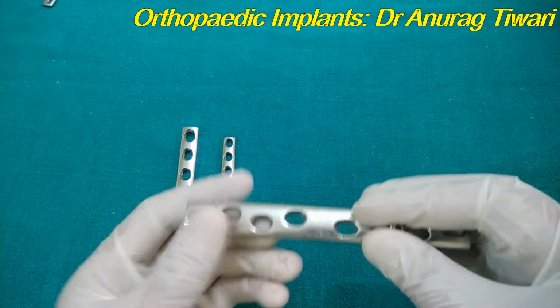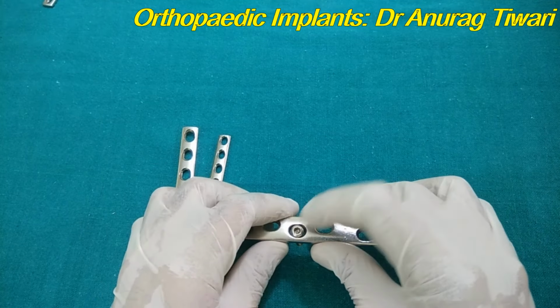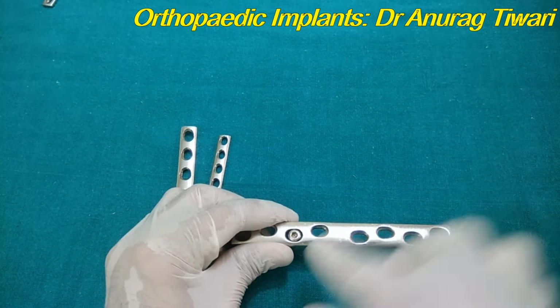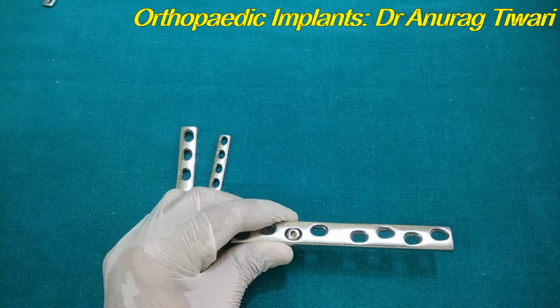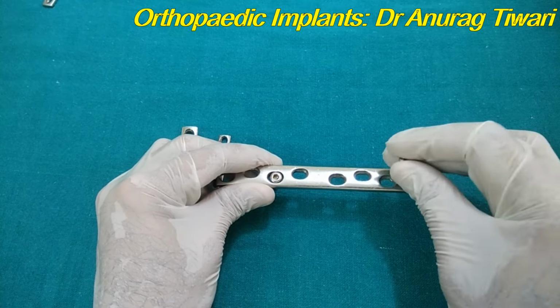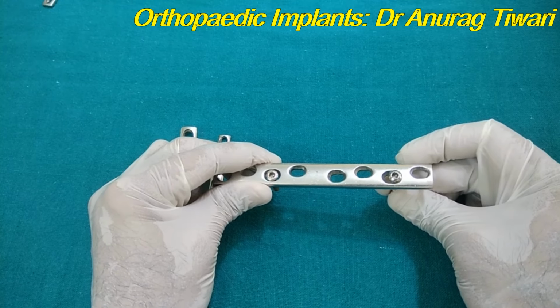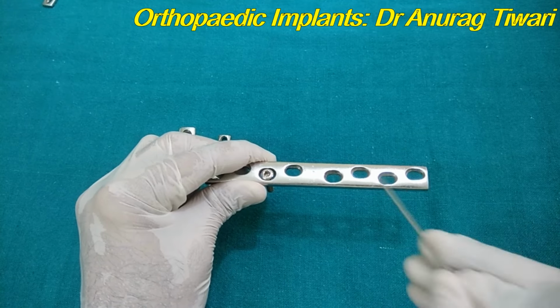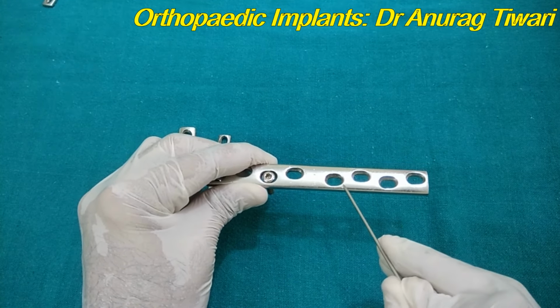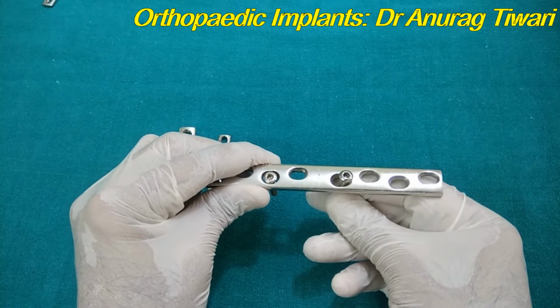So what is the principle here? We fix one fragment with the screw in the central mode, or we can say the neutral mode. When we fix the screw in the center of the hole, it is the neutral mode, and the other screw we fix in the eccentric mode, or we say the compression mode. So while keeping this eccentric, away from the fracture site, we insert the second screw in the opposite fragment of the bone in the eccentric mode. So we will fix it over here.